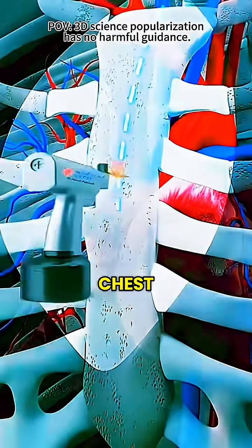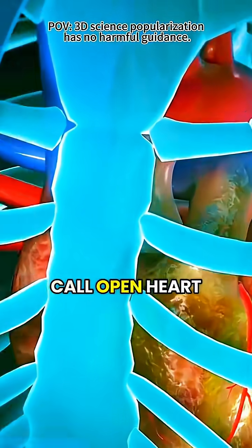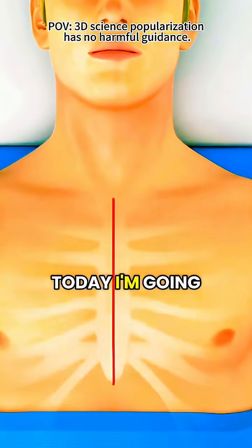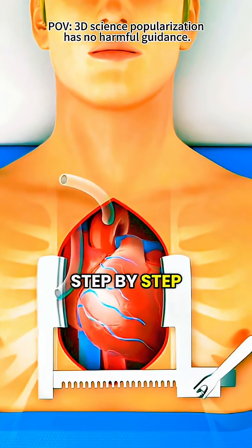Imagine a surgeon opening up your chest and working directly on your heart with careful precision. That's what we call open-heart surgery. Today, I'm going to walk you through exactly how this kind of surgery is done, step by step.